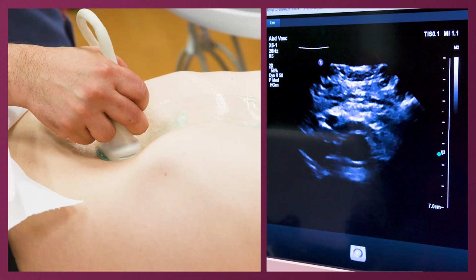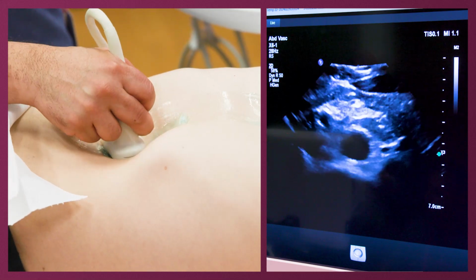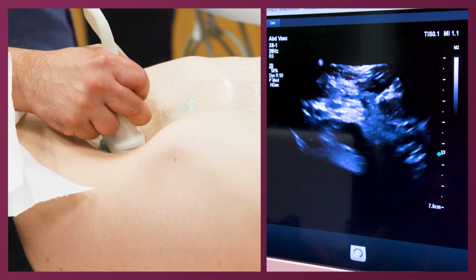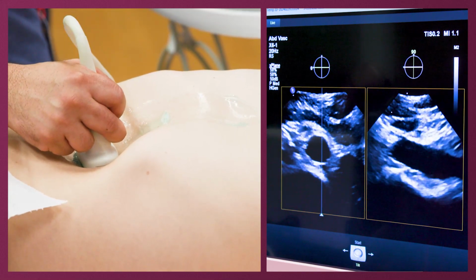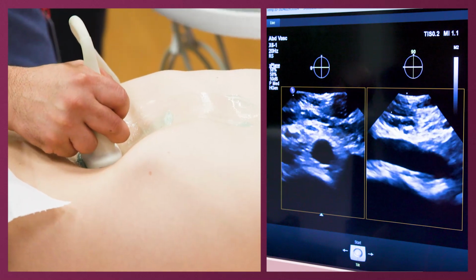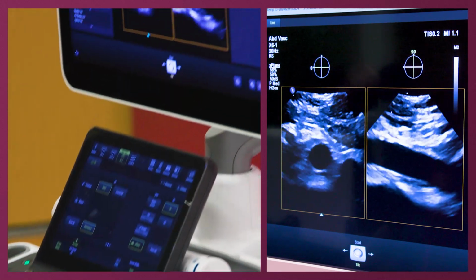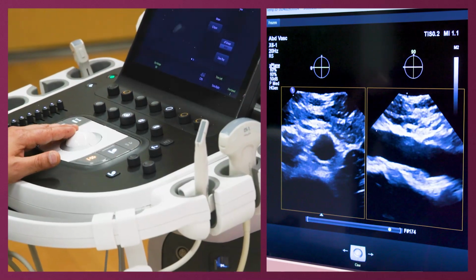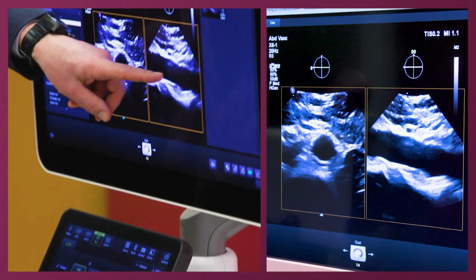I warn you, this application has been made and tested and validated on patients with aneurysm. And this is the smart stuff. So now I get two planes. Now you need to tilt, so you get this perpendicular. And you can play it. I'm not satisfied. This is not perpendicular.